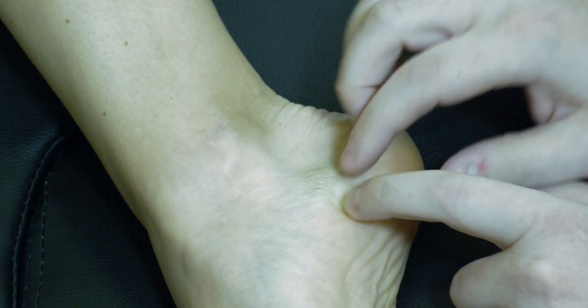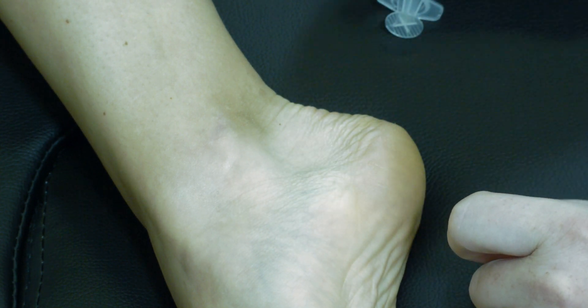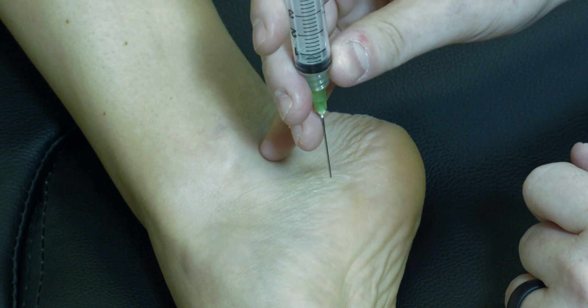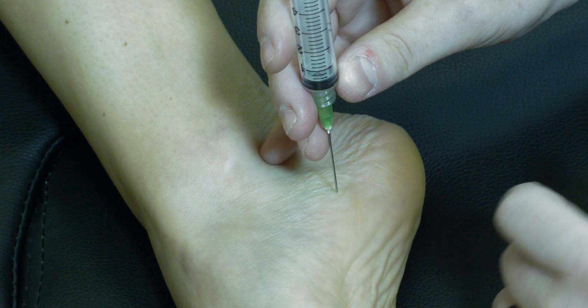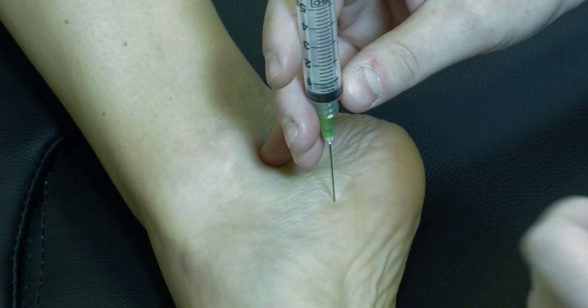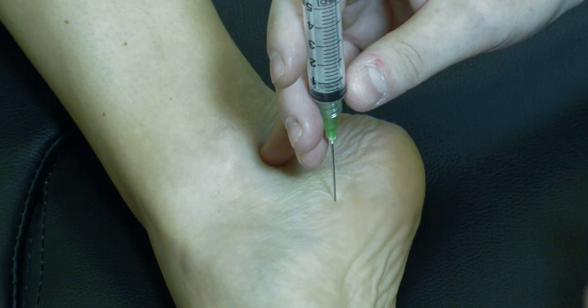Mark that point with your pen, then clean as per your usual technique. The injection is at 90 degrees to the skin, straight down, advancing about a third to two thirds the length of the needle. Aspirate to ensure you're not intravascular, and then inject whatever injectate you may be using.